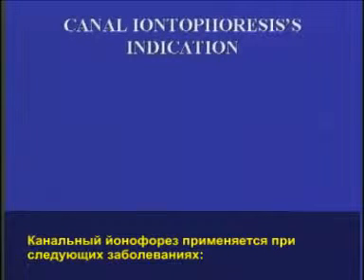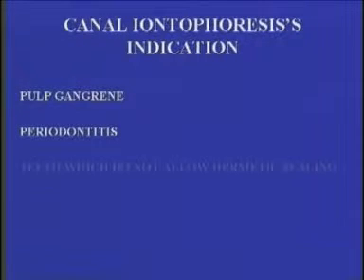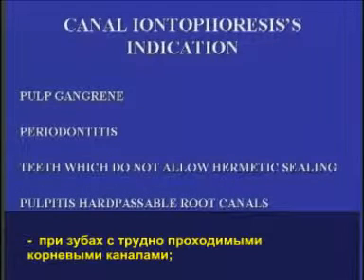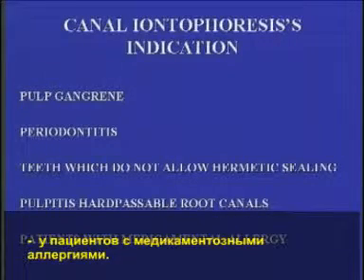Canal ionophoresis is applied in the following cases: pulp gangrene, periodontitis, teeth which do not allow hermetic sealing, pulpitis with hard passable root canals, and patients with medicamental allergy.